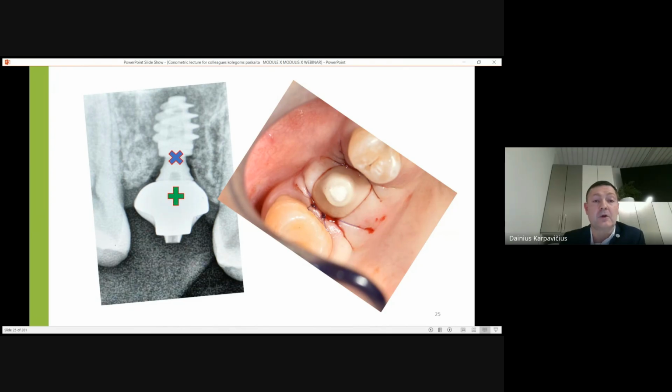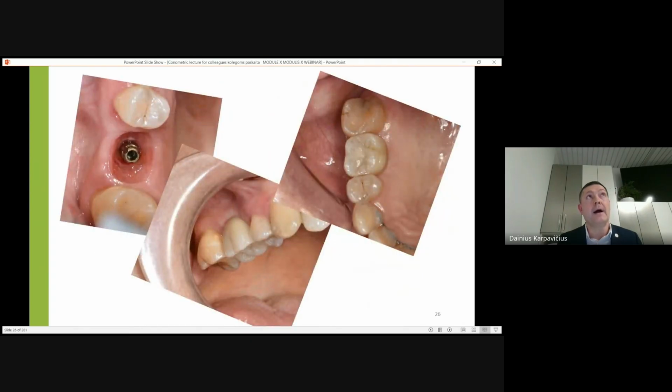And later on, as I told previously, we are working on the second level, on the second floor, in the field of soft tissues like epithelium, and here our environment of the implant is much more friendly, not painful, no bleeding. Take a look at how the soft tissues look, and we don't go deeper, close to the implant.